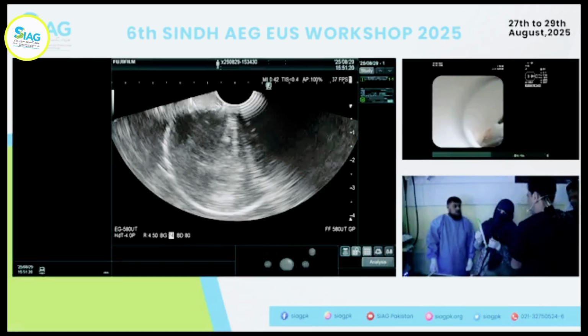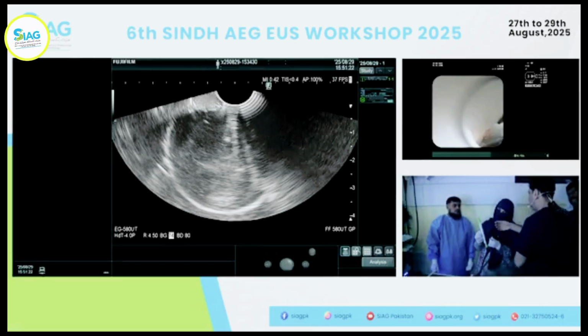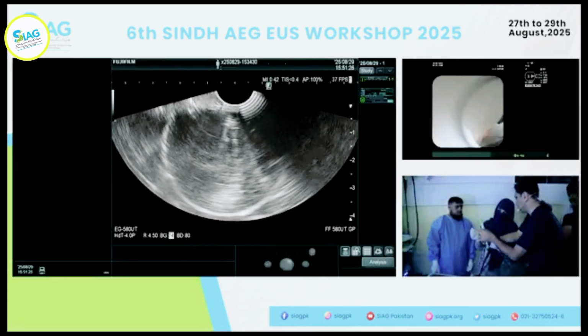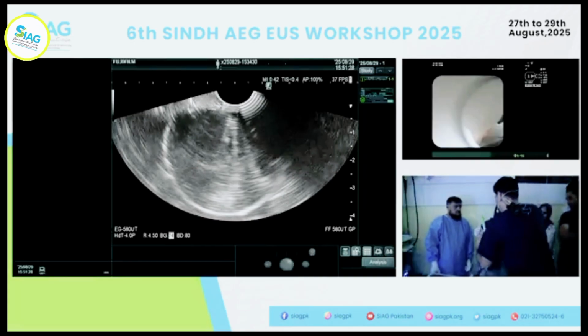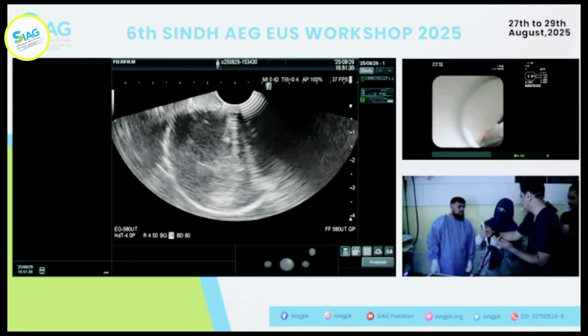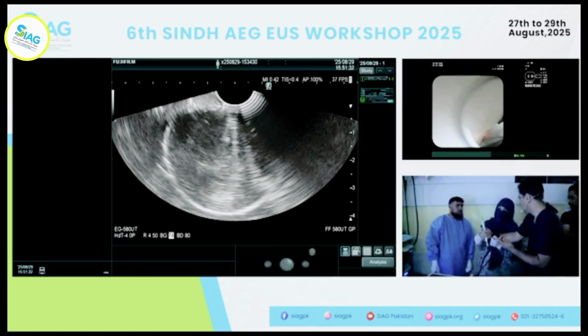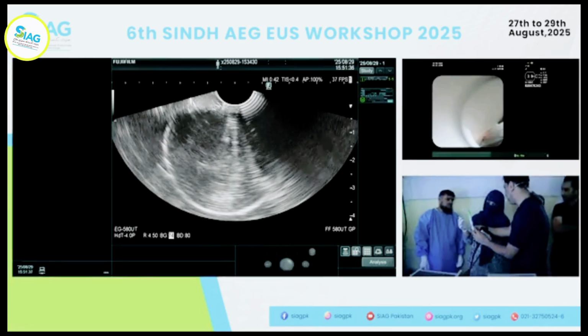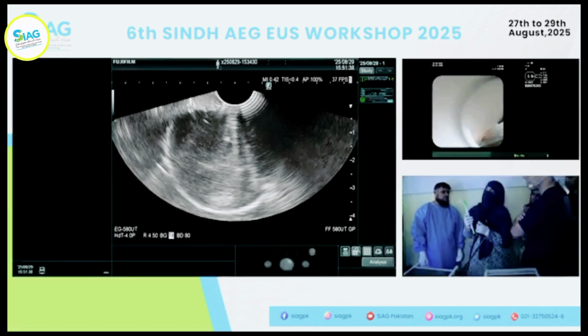It's up to you. In earlier days, somebody can, but you don't actually have to, because you're actually going to do it. Oh gosh, it's very hard. If you're holding it like this, then it shouldn't be a problem. But if you want to be safe, you can do that. I think there's no harm. Yeah, you can do that as well.